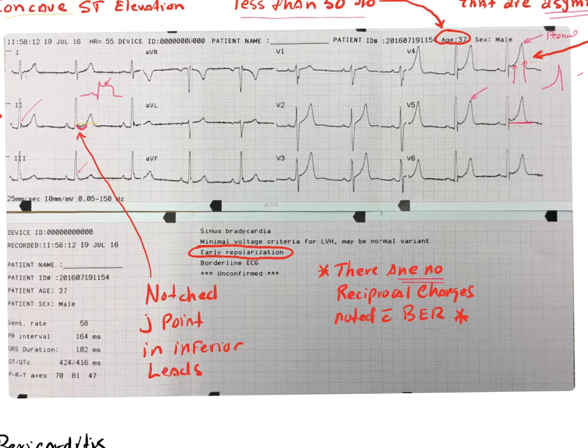And so it kind of blends into the QRS a little bit, and it gives a false appearance of ST elevation. Does that make sense? But the only thing that's going on here is it's just repolarizing just a little early. That's all. It's not a big deal.